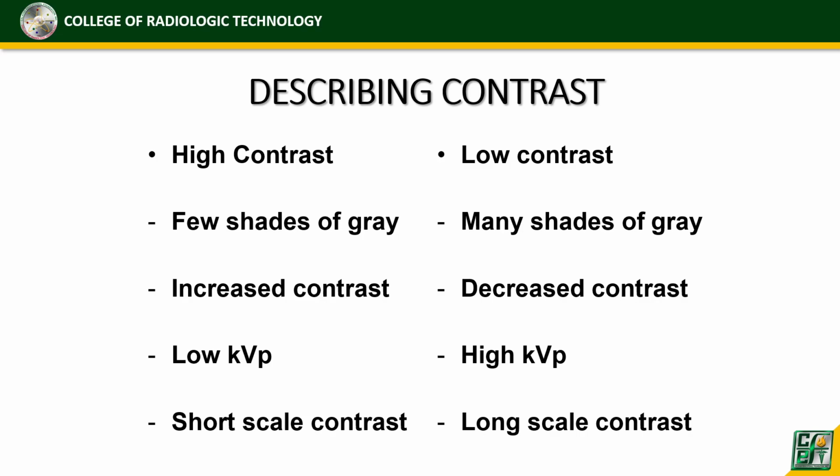And we use low kVp for high contrast. High contrast is what we call the short scale contrast, kasi there are few shades of gray.